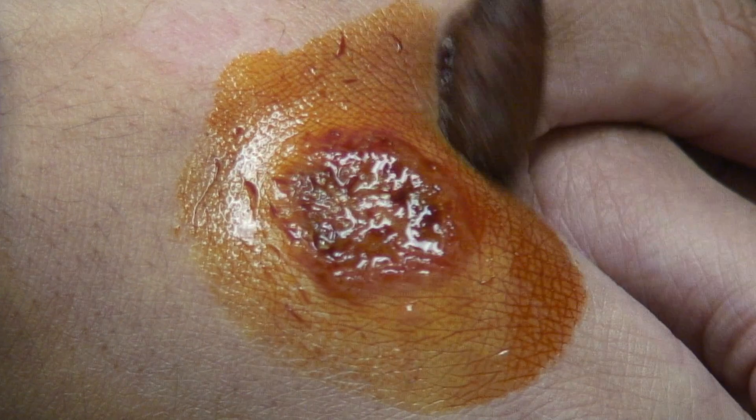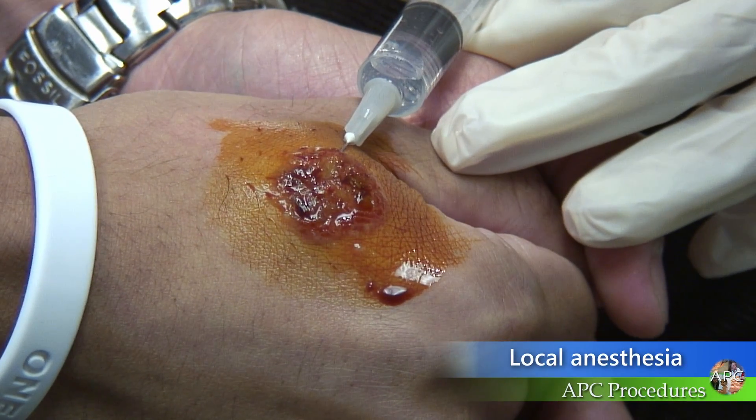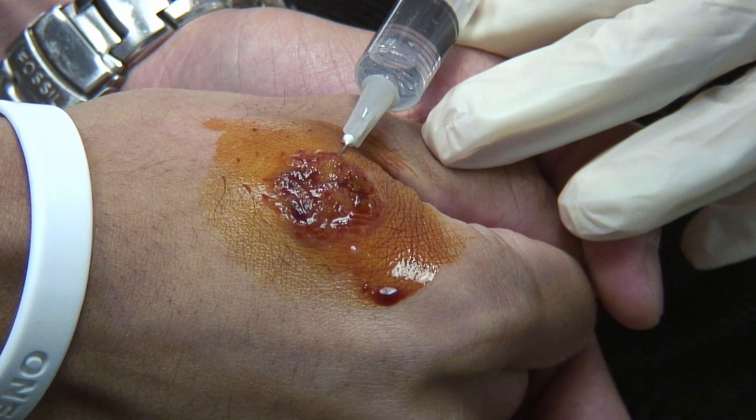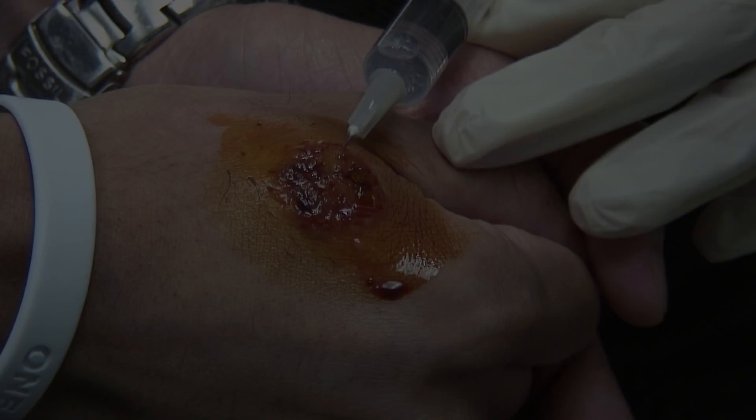Cleanse the site with alcohol or betadine solution. Infiltrate anesthesia around the lesion, or the part of the lesion that will be biopsied, in a large enough wheal to make sure that there is enough anesthesia if suturing is needed after the biopsy.